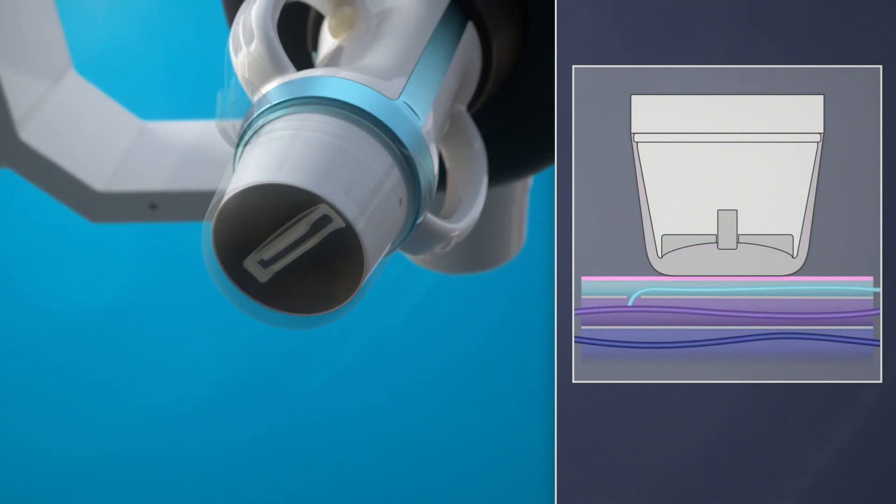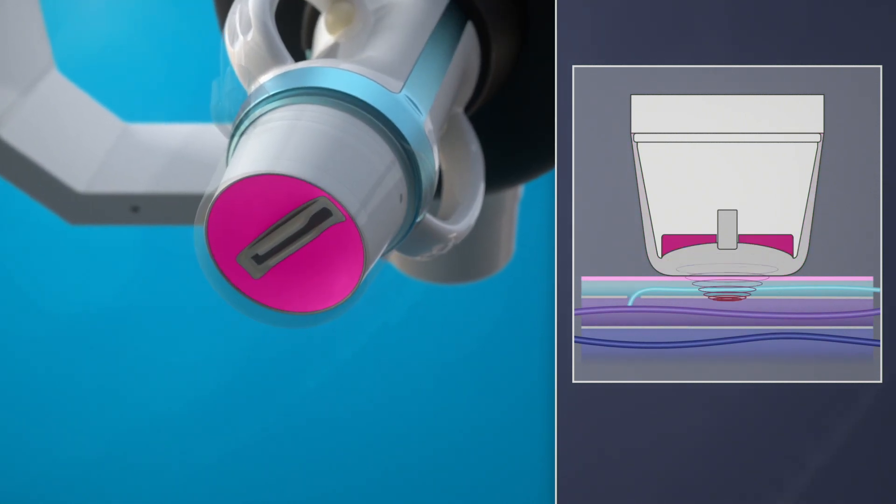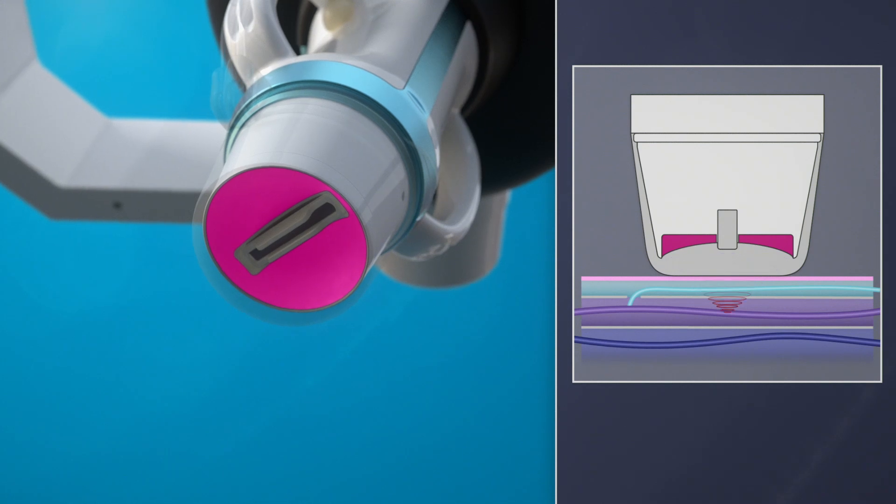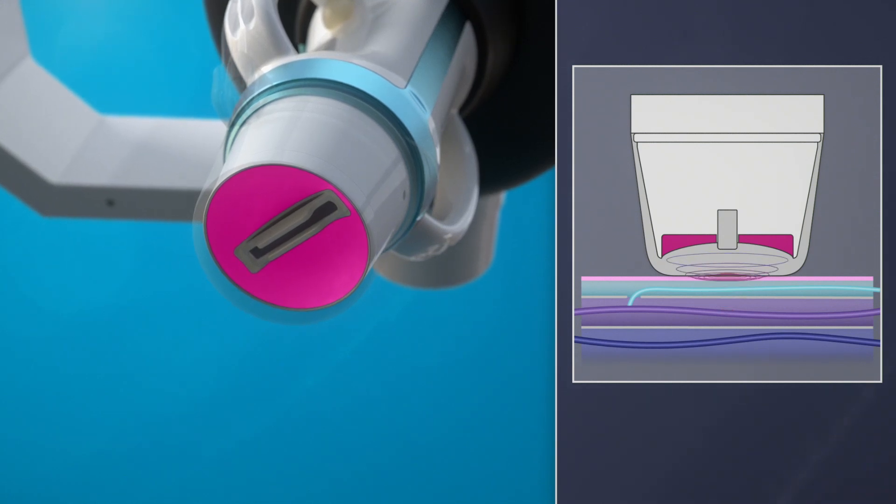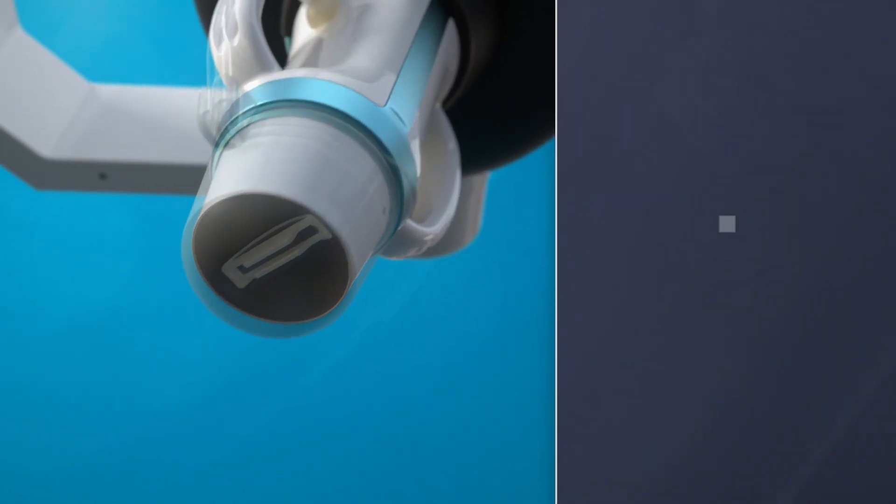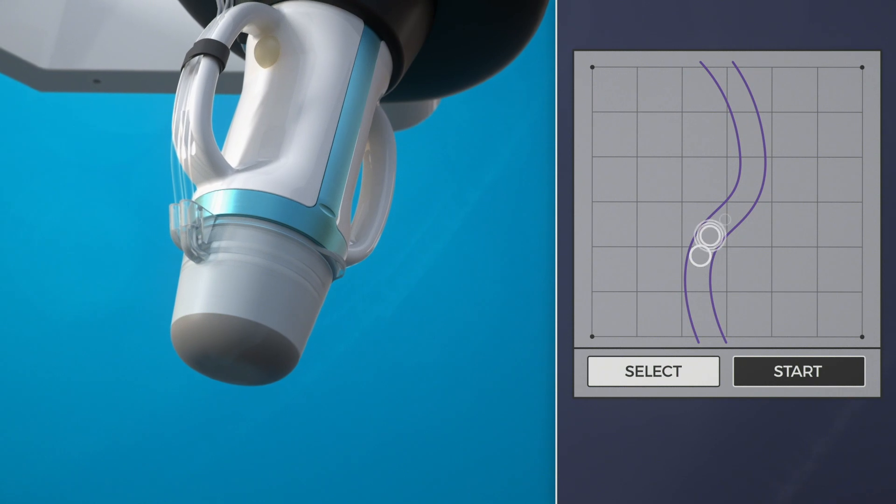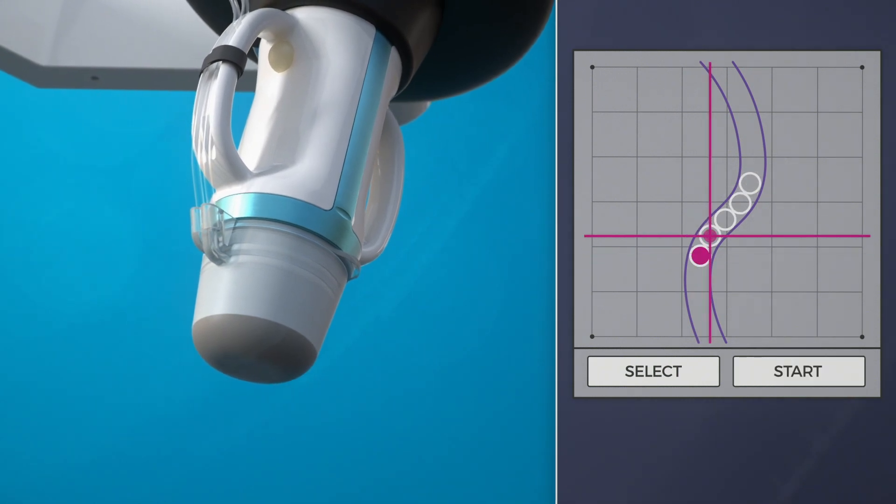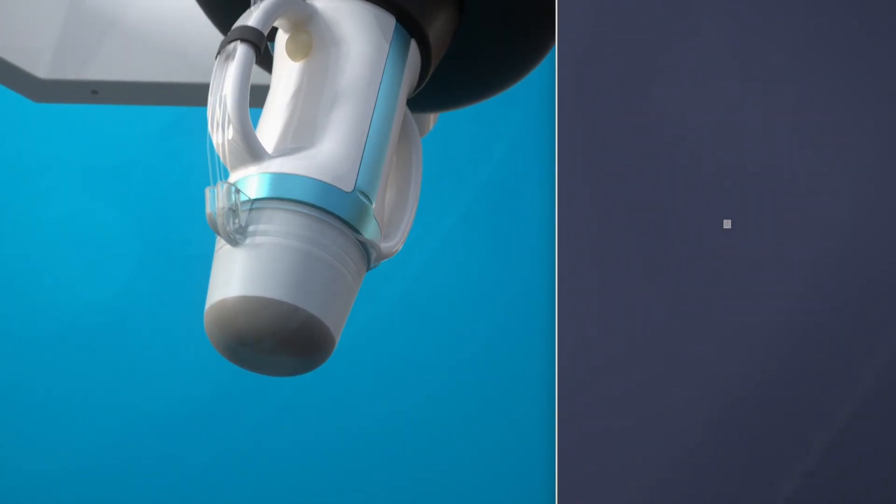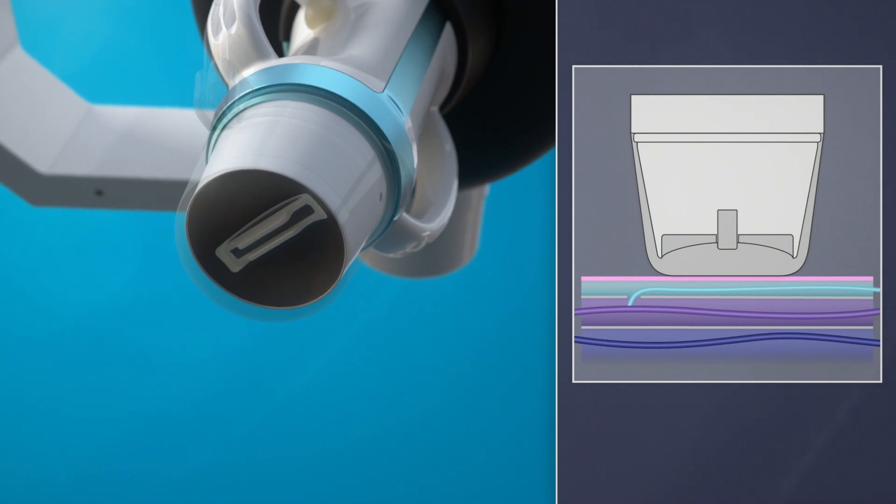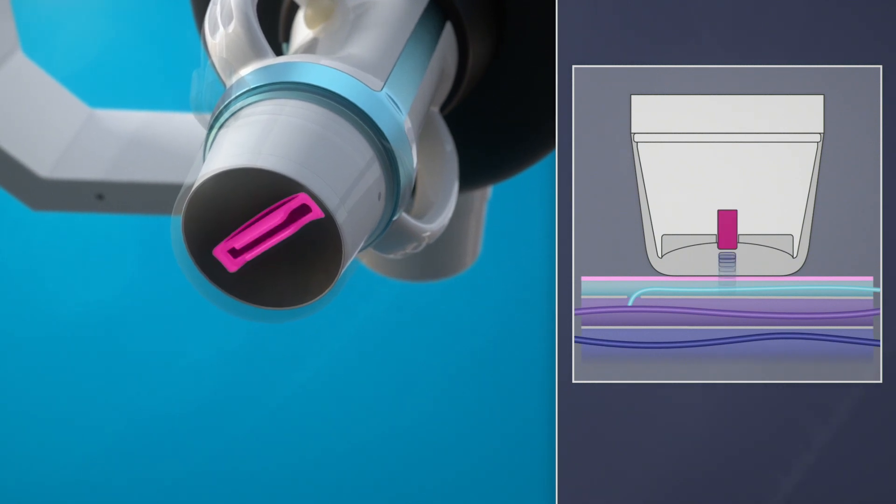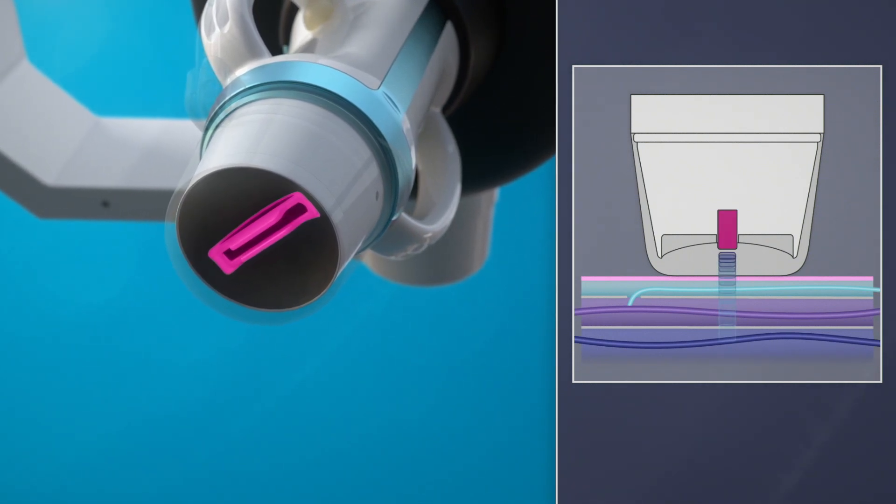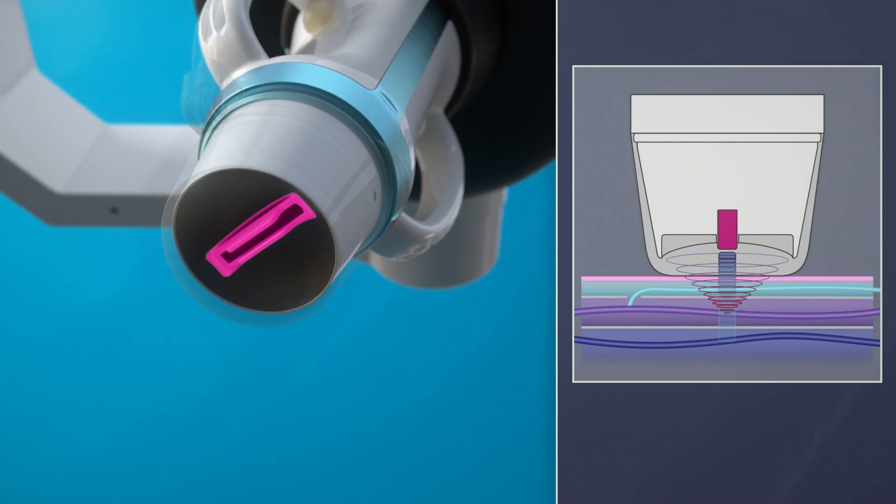During treatment, a high-intensity ultrasound beam is focused on the vein. As the thermal energy is delivered, the vein shrinks and is sealed closed. All step-by-step and automatically steered with a touchscreen monitor. An in-beam linear ultrasound probe allows visualization of the vein in real-time and ensures optimal accuracy.